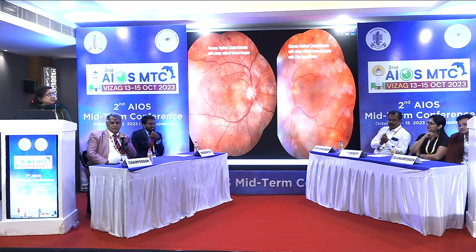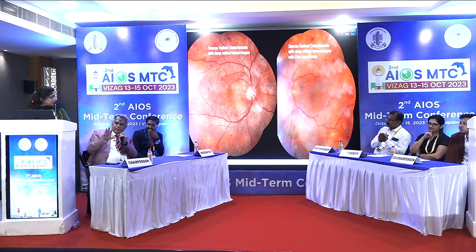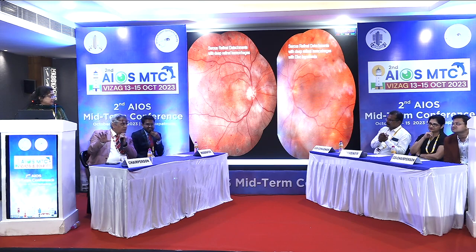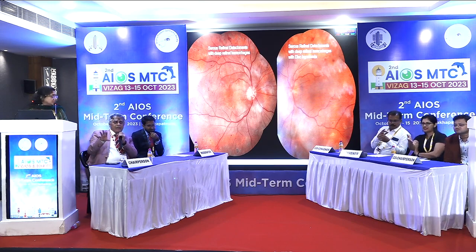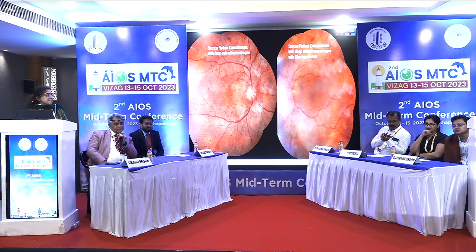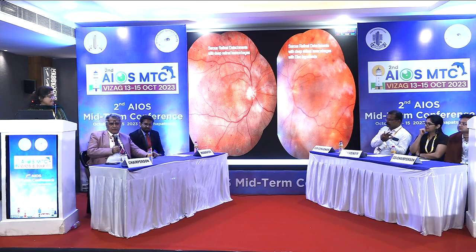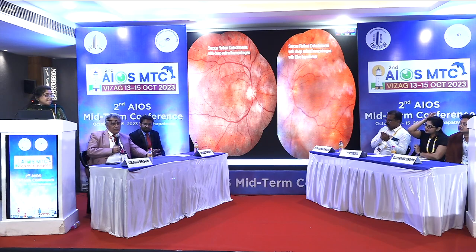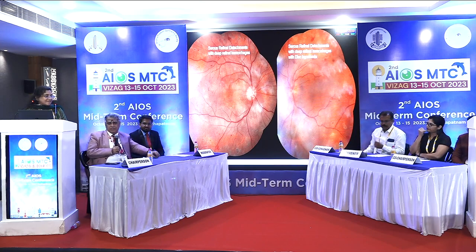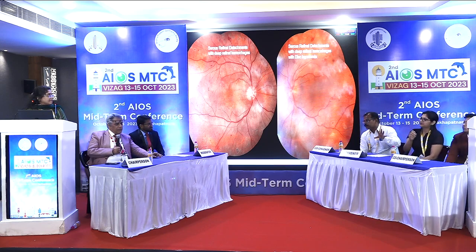Yeah, but there are case reports. Did you get his renal parameters done? Yes, sir, they are normal. Because you see, a lot of patients with PDR, if you get some cystic swellings, uveal effusion is very well known in renal hypertension also. In a patient with renal hypertension, you should get his kidneys evaluated very nicely. Yeah, kidneys are all normal. But the OCT picture is typical. I had one lady long time back, where we published also, with renal hypertension having a picture like this. But this fundus actually looks too good for renal hypertension. But renal would also have multiple exudates. Yeah, multiple.